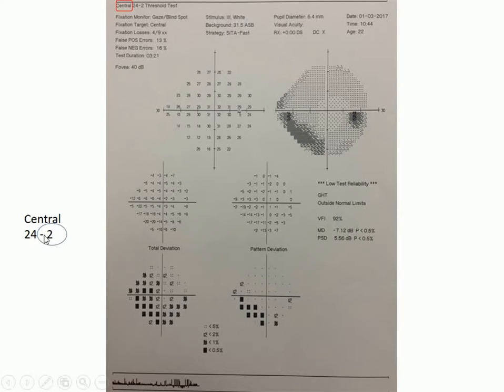So what about this -2 that I keep alluding to? Well, the idea here is that when the testing is done, and we'll see this more carefully later, if we have the horizontal midline and the vertical midline, that testing is always done on either side. It's not done on the midlines themselves.